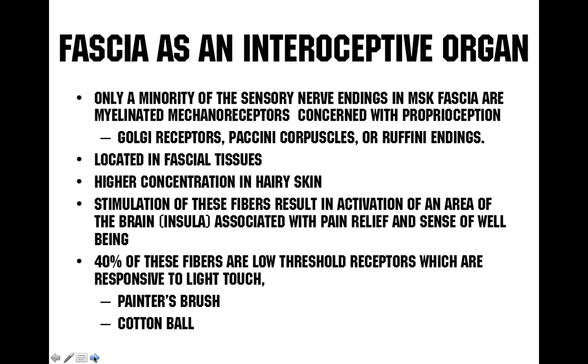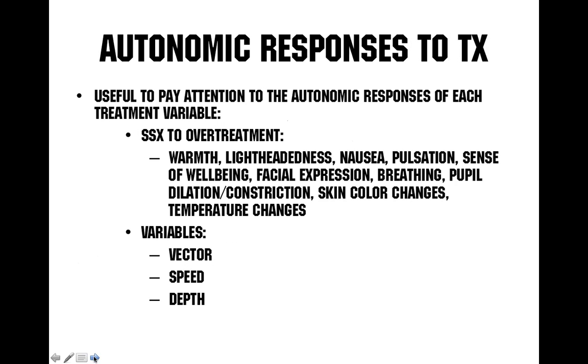So I've taken 10 steps back from my original treatment ideas and helped with education, taking these tools, letting people touch them and understand them, to control their awareness and take them off threat before I lay them prone and start working on tissue. And if I can say anything within this coursework, this is the primary outcome I'm trying to achieve: relaxation, and understanding and awareness of what we're trying to do to their tissue.